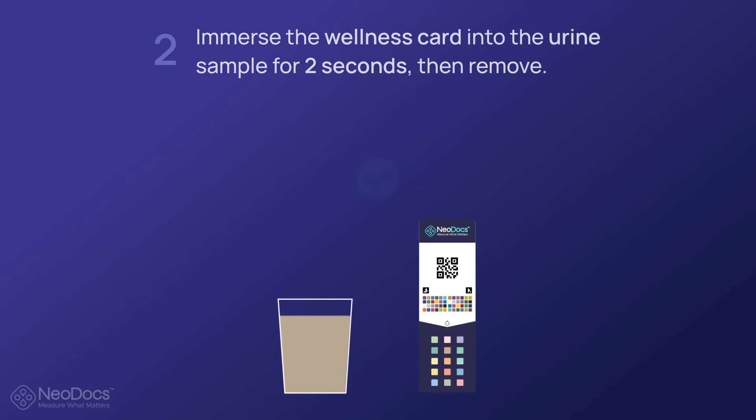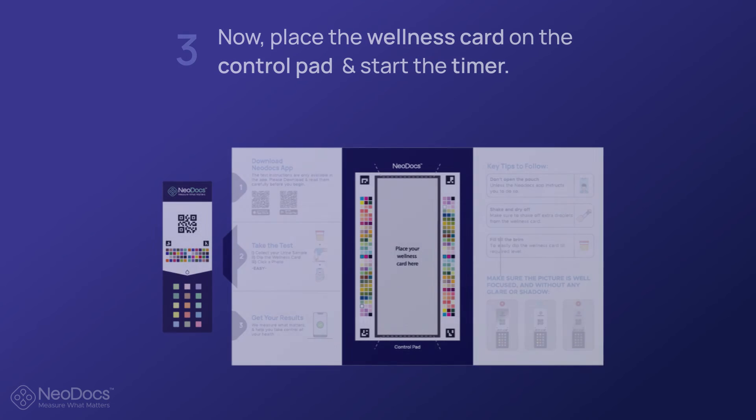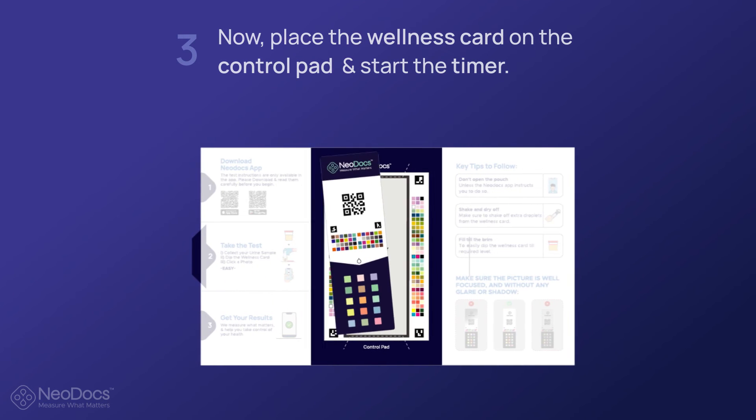After removing the card from the sample, tap or shake the card gently in order to remove excess droplets. Activation of your card commences as soon as you dip it in urine. Please ensure you scan the card between 60 to 90 seconds of activation.